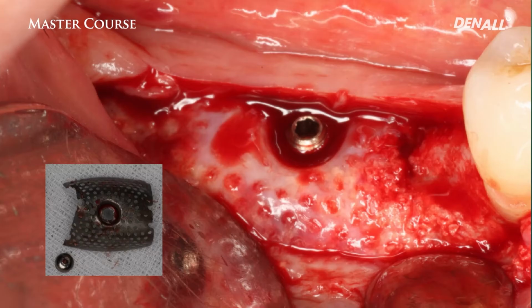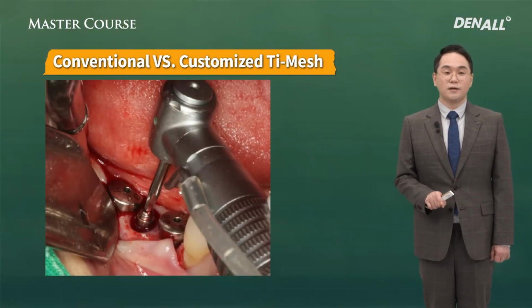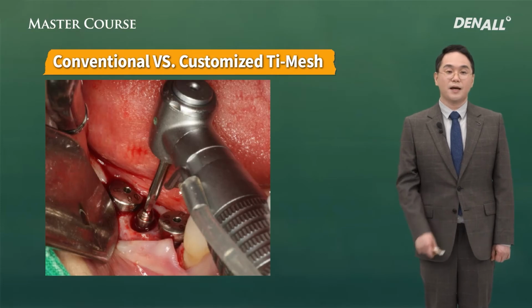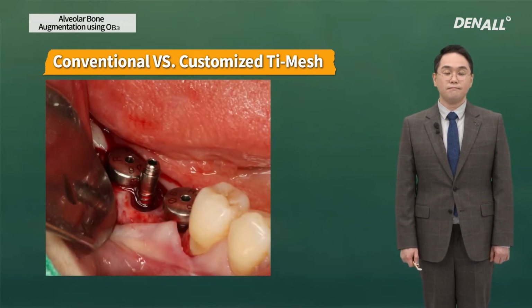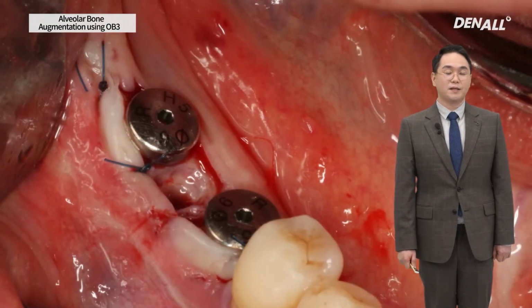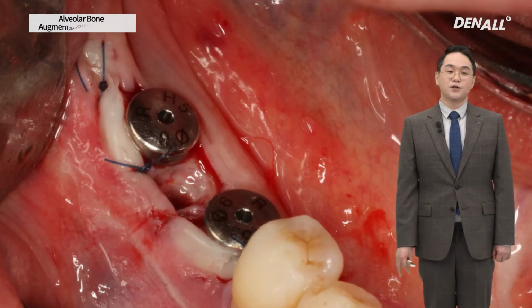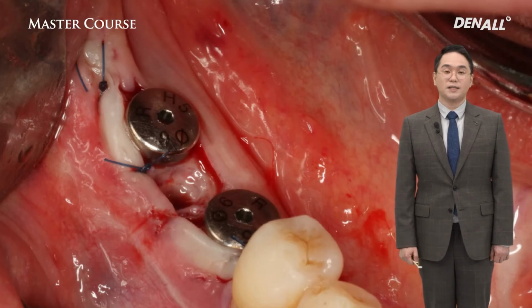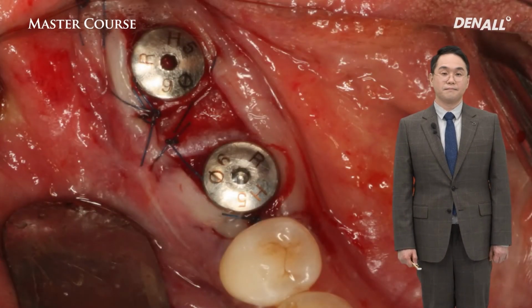The driver used to fix the tenting screw is reversely rotated to remove the screw. It is easily removed. After that, healing abutment is connected and keratinized gingiva needs to be increased buccally, so apically positioned flap is also performed.